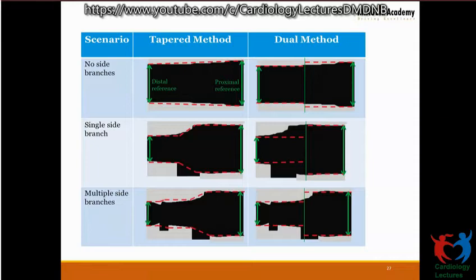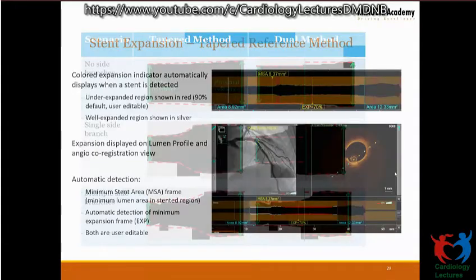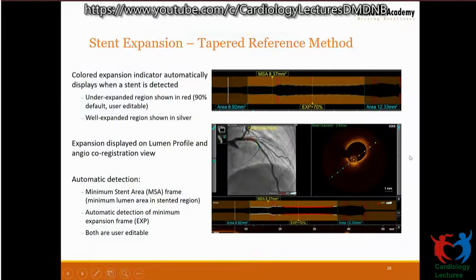If I use the proximal reference, which is the left main size, the stent, even though optimally expanded, will be shown by the machine as under-expanded, because it possibly cannot achieve the areas which the left main achieves. So you divide the vessel into two halves. The proximal reference will be applicable only for the first half of the vessel. The expansion of the stent will be assessed based on the proximal reference size, and the distal reference will be applicable to the distal half of the stent. So this is an example of a tapered reference.